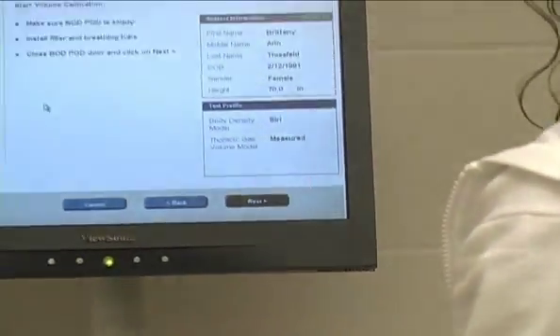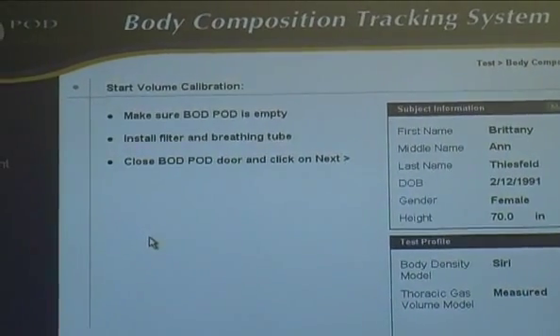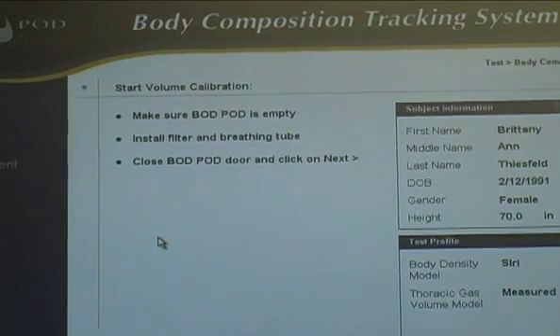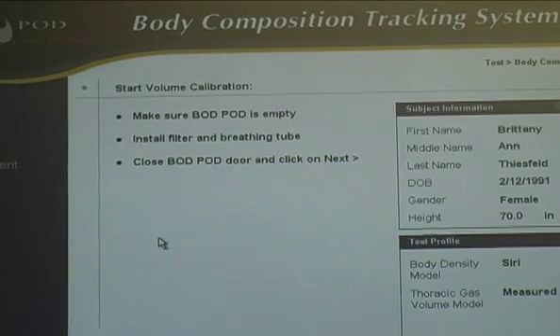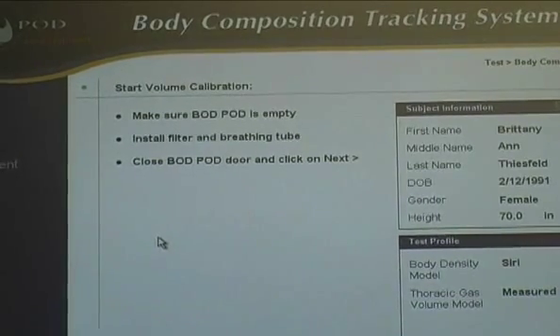Okay. Again, just read and it tells you. Make sure the BOD pod's empty. Is the BOD pod empty? No. We need to take that cylinder out. And we want to be sure that we don't drop it, because it does dent.